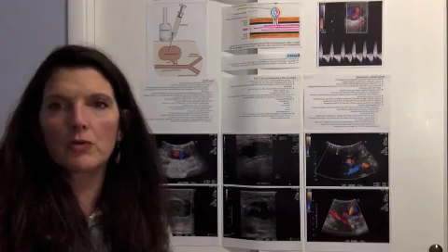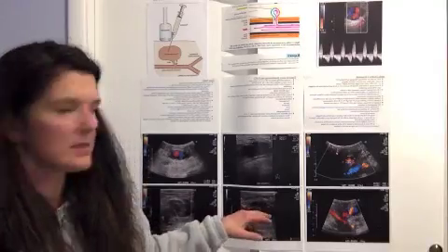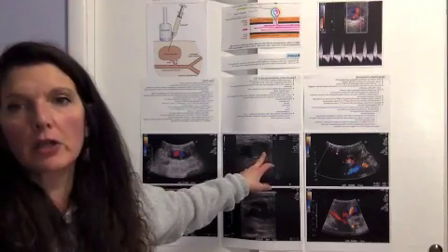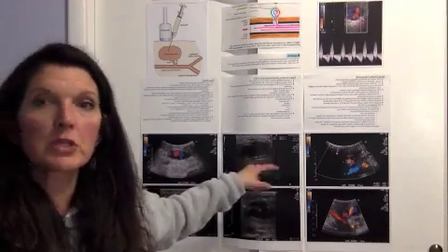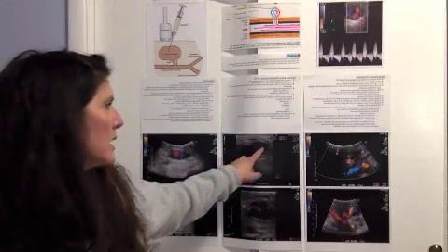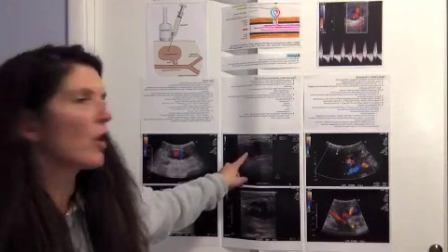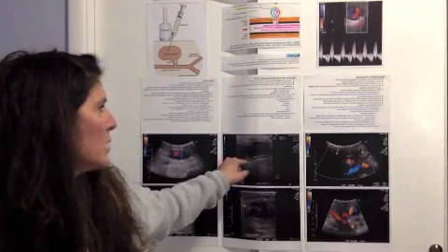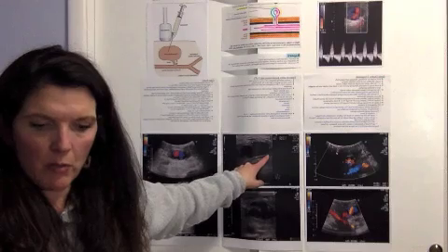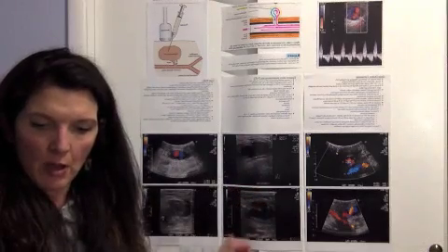So they ordered an ultrasound exam for the following day, and in that exam, we noted a multilocular pseudoaneurysm, which means there were 2 lobes. In this case, it's hard to see because I don't have the color image here, but this is 1 lobe and this is another lobe, and then the neck is somewhere in here in this picture. In this case, the overall measurement was closer to 3 by almost 2 centimeters.